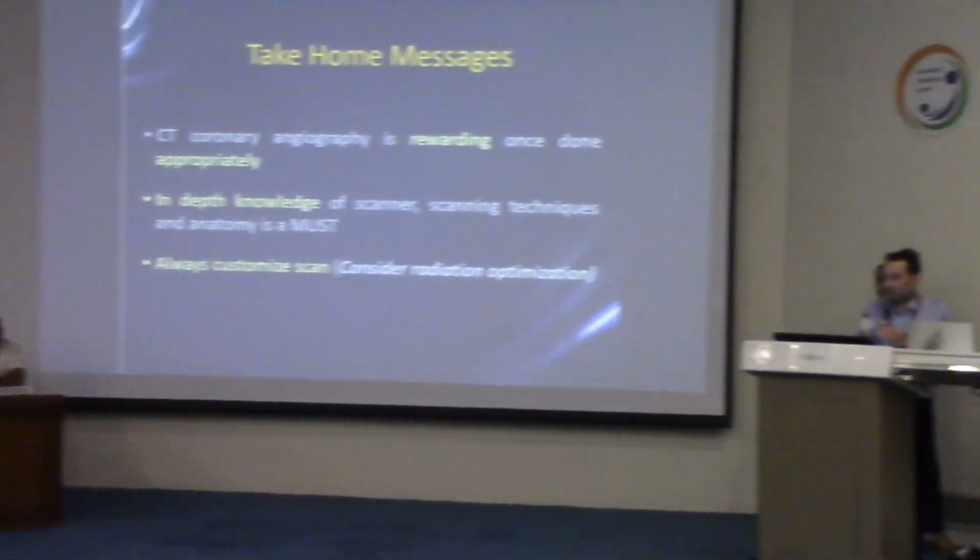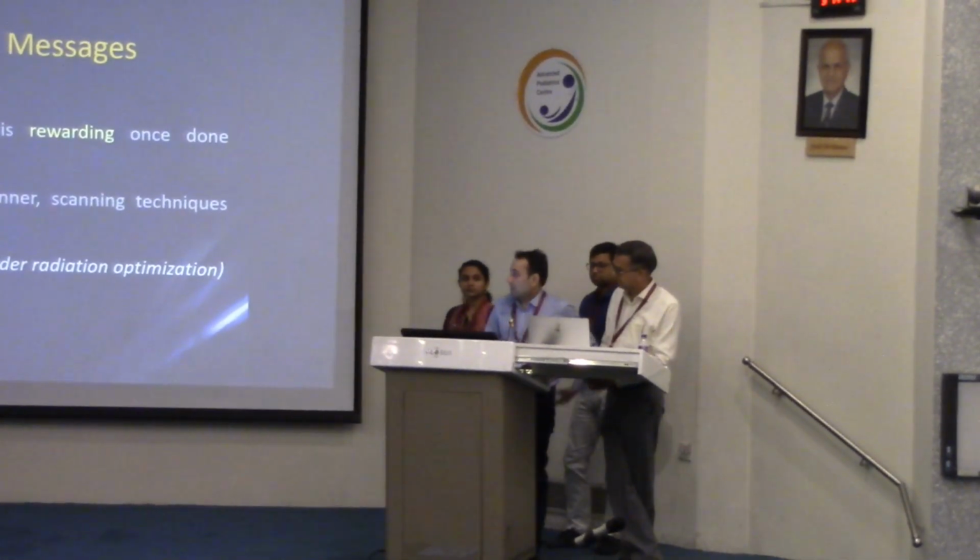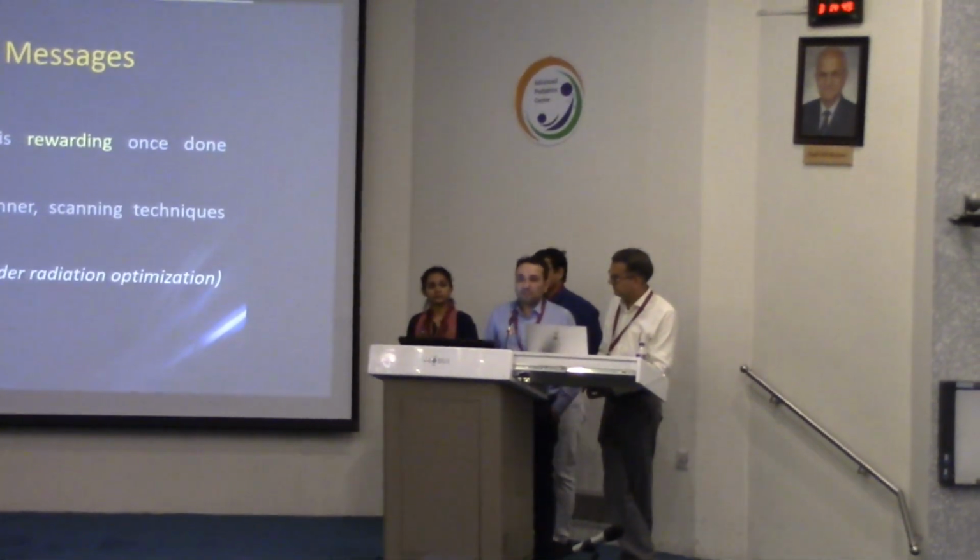Before they ask questions, I can just start, because sedation is always an issue in young children. How we are dealing with sedation here is that children above 5 years of age mostly do not require sedation, and for children below 5 in CTCA we use sedation with triclofos, like Pedicloryl, followed by midazolam.